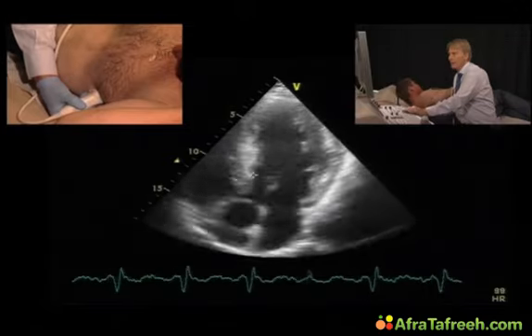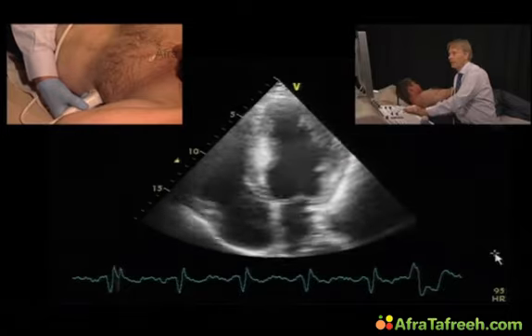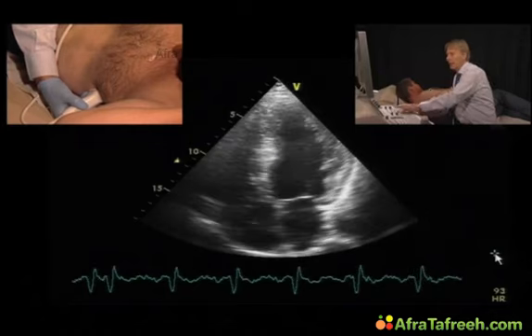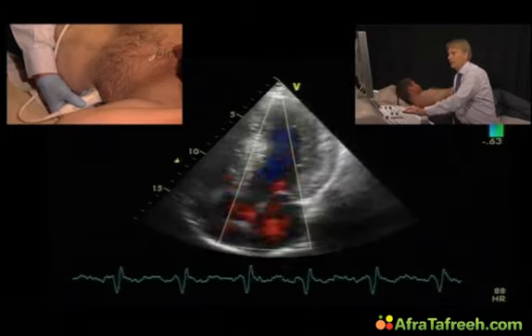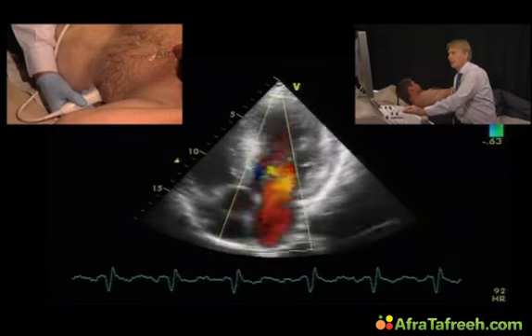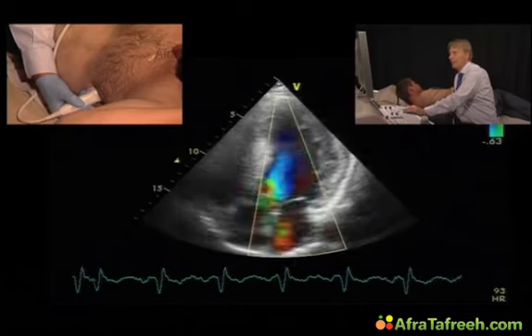It doesn't even come close to the septum, and it's only the chordae and not the valve itself, so there is no obstruction here. And if we look at the color, we also don't see any obstruction or turbulent flow in the LVOT. By the way, we also don't see any mitral regurgitation, which is also something that we would see quite frequently if patients have SAM.